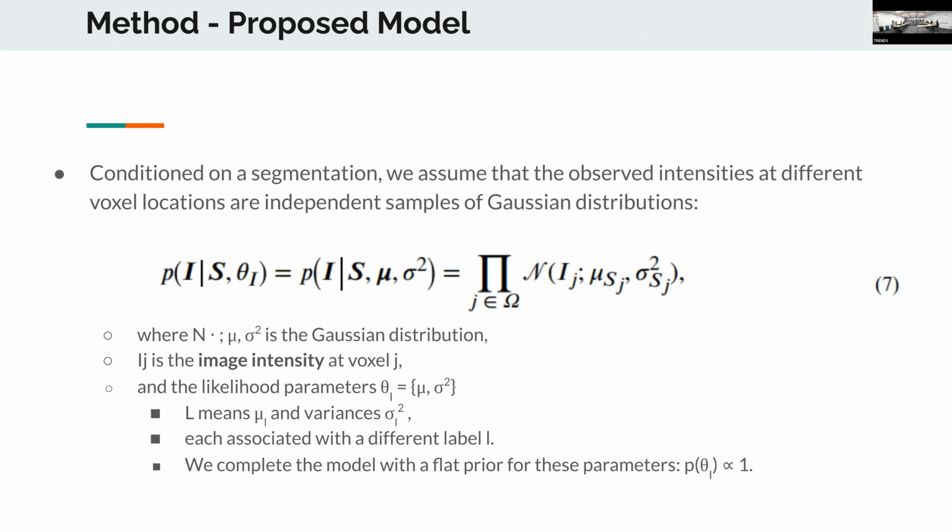So after you sample from your distribution, for every voxel you get a vector of values. This vector is of size labels, and this vector sums to 1. So that's what the sampling does for you. That's what gives you the likelihood. It gives you the likelihood values for that voxel for every label. And their probabilities, so they all sum to 1.